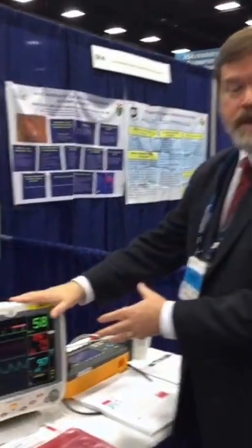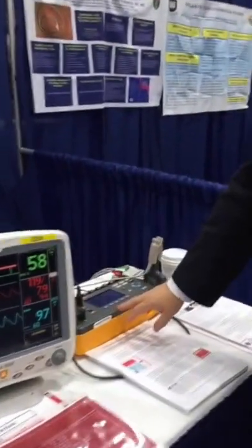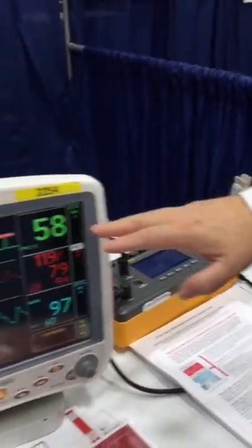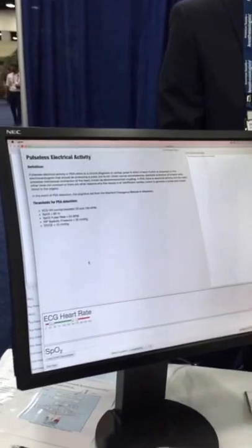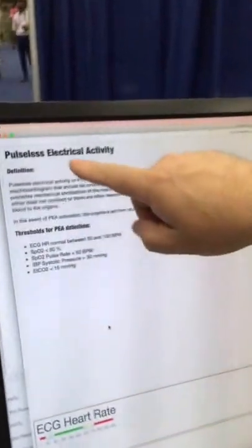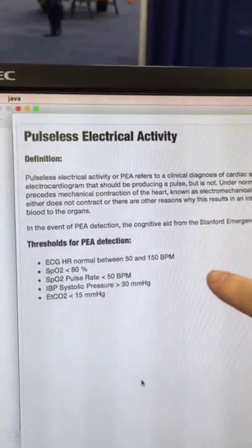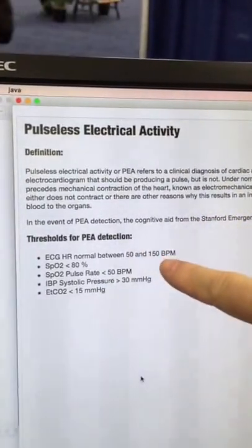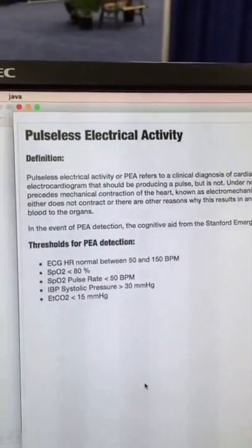We have a real patient monitor here and instead of a patient we're using a simulator, and that allows us to control the screen of the monitor. The data from the monitor is being continuously analyzed by an app running on the computer. The app is looking for pulseless electrical activity, defined by looking at the ECG heart rate, the oxygen saturation by pulse oximetry, the pulse rate, blood pressure, and end tidal CO2.